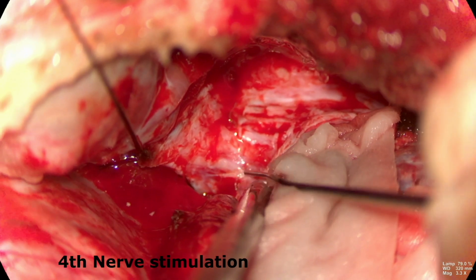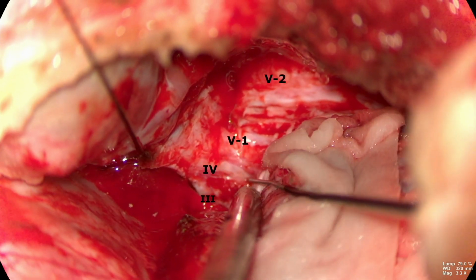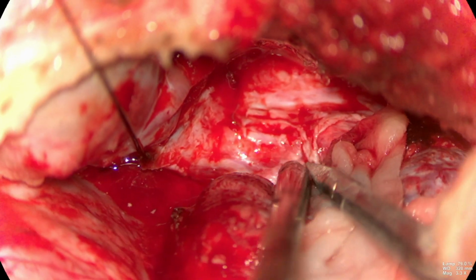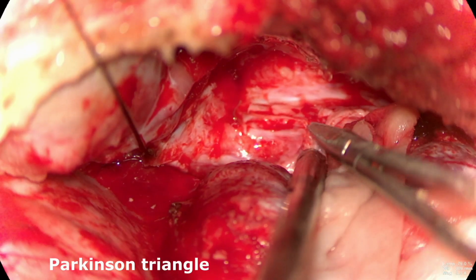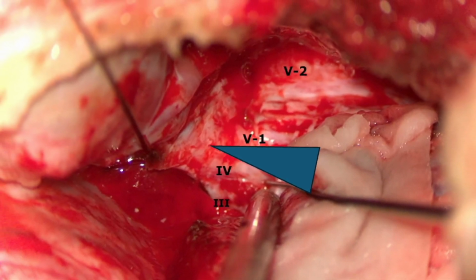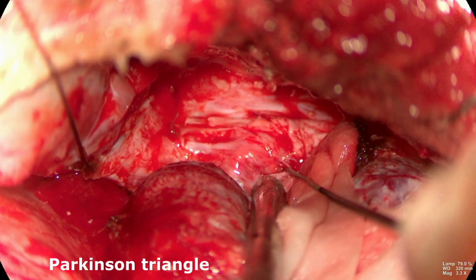Further dissection revealed all the cranial nerves lying on the lateral wall of the cavernous sinus: third, fourth, V1 and V2 division. And now we understand where is our Parkinson's triangle, between the fourth and V1, as shown by this blue triangle. This triangle was utilized to decompress this tumor.